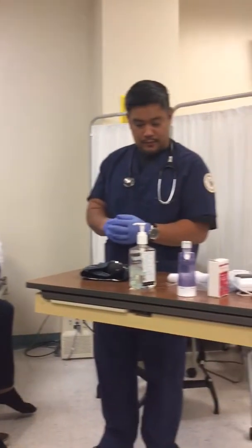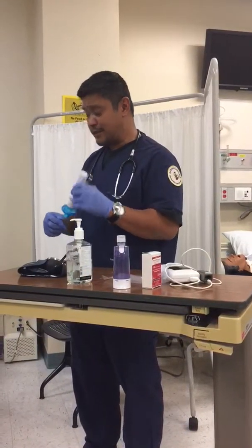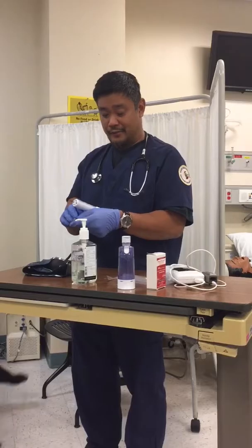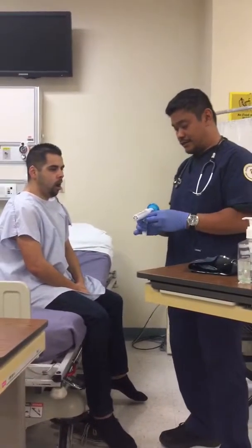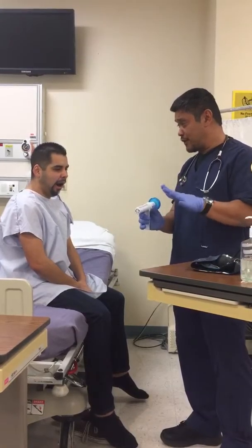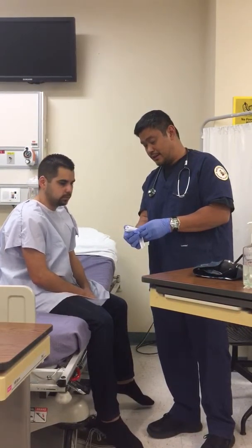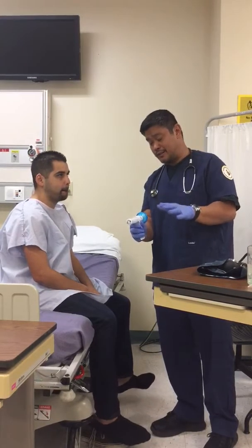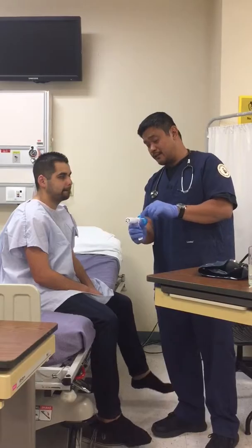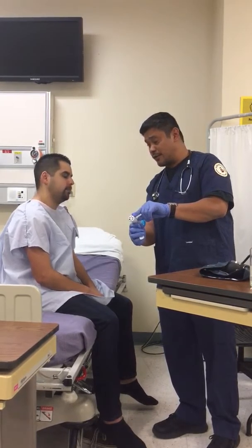Okay, and we'll also be doing a peak flow meter, and we'll be doing this twice, once now and then after we do treatment. So what I'd like you to do is blow out as hard as you can. I've set the goal for you according to your height and age. It's like blowing out a birthday candle, and I want you to move this indicator as close to that goal as you can. Okay.